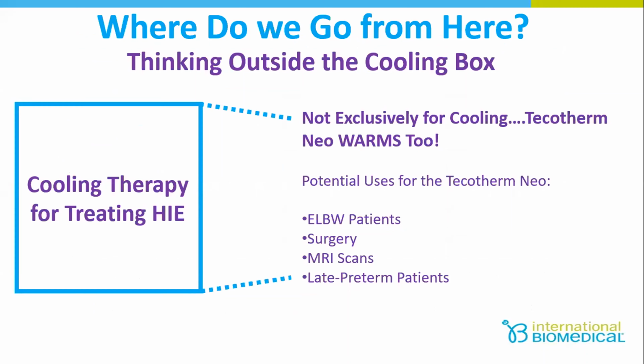Well, you fast forward a couple years after using it, it was like, all right, this is great. We've done a lot of thermal regulation work. Is there any other place we could potentially use this device? And when we look at our kids that were not cooling, but just doing our intervention, kind of like that Mercy Children's study, we were able to get to about 90% of our patients between that 37.5 mark.